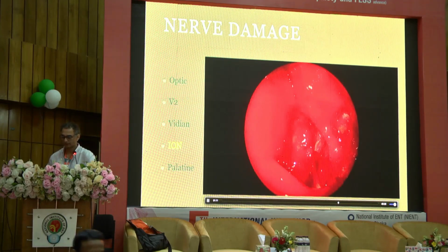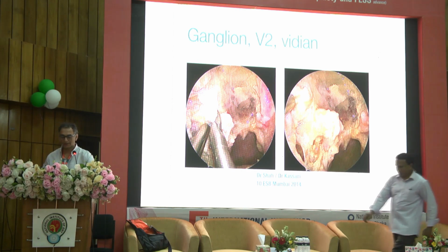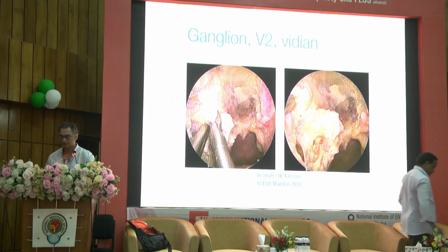Okay, further back, if you are going towards pterygopalatine or you're going transpterygoid, transmaxillary, then you will enter the infratemporal fossa area, where you will see the sphenopalatine ganglion. If you were to cut that or open that up, you see these two nerves that everyone's familiar with, right? The Vidian nerve going into the pterygoid canal, V2 going into the foramen rotundum, the V2 canal, okay?